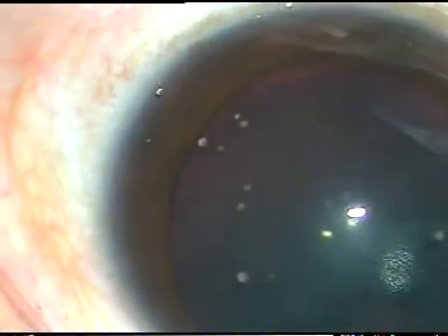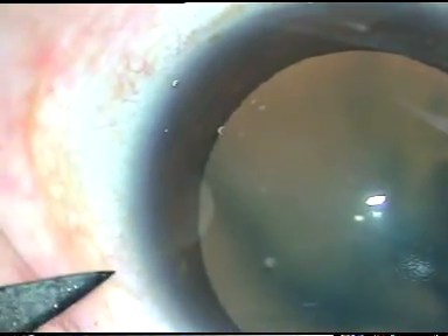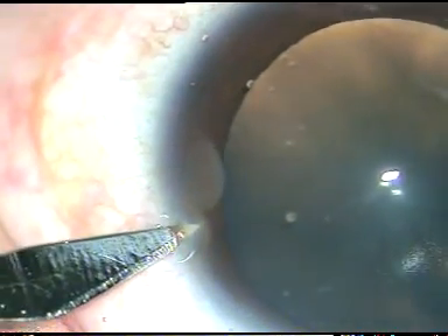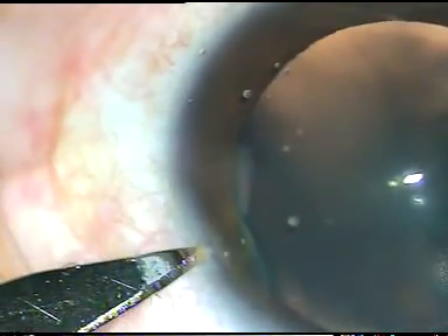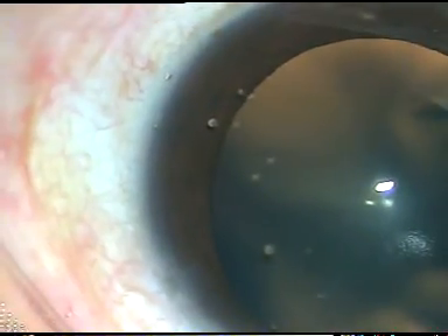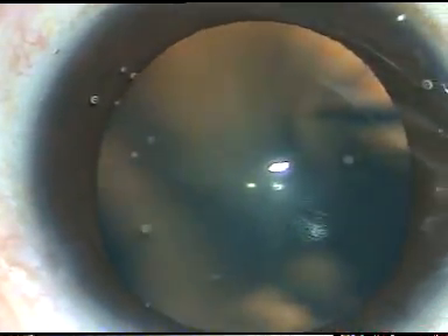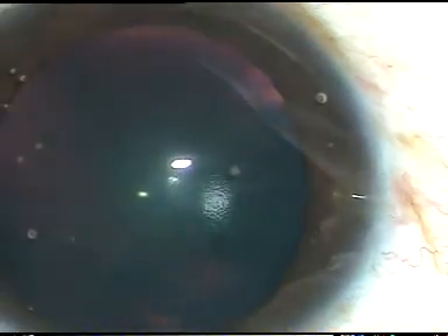After I am sure — after you can see the needle — I ask my assistant to inject it. Then I do a small stabilization and express out some aqueous humor with a little paracentesis, so that the optic nerve is not damaged. Now I will pull the needle out and tease the area. That's it.